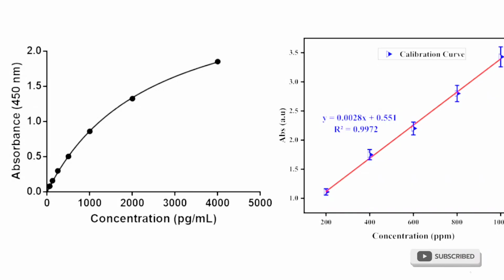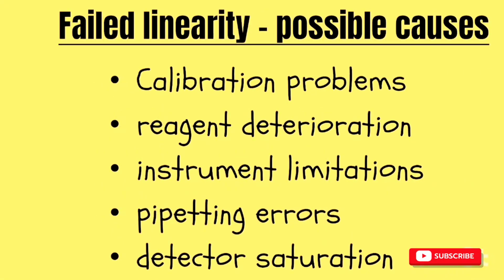That is wrong, in the way that it did not increase the sensitivity, the comfort zone of the analyzer. The closer the calibration curve's R-squared is to 1, the more you are increasing the comfort zone or the sensitivity of that very analyzer. Does that make sense? So when calibration is not properly done, that can make the linearity fail.